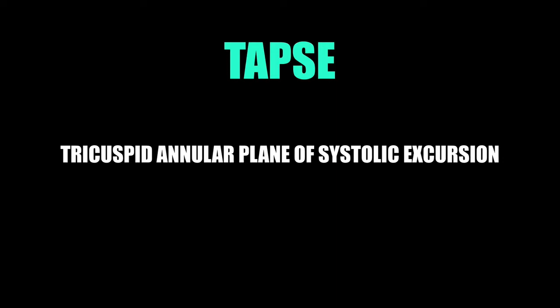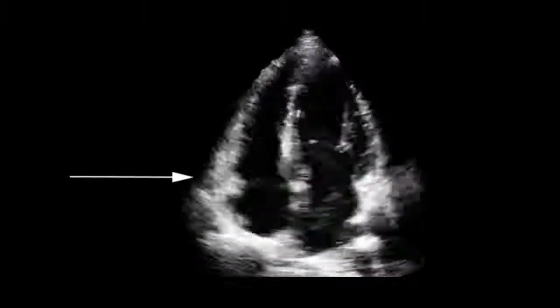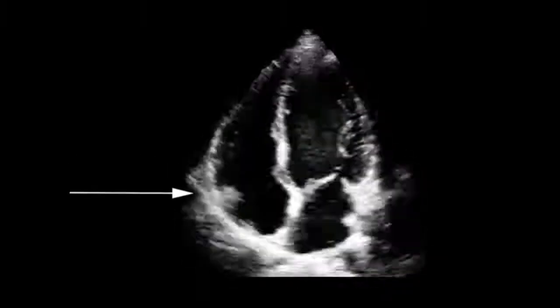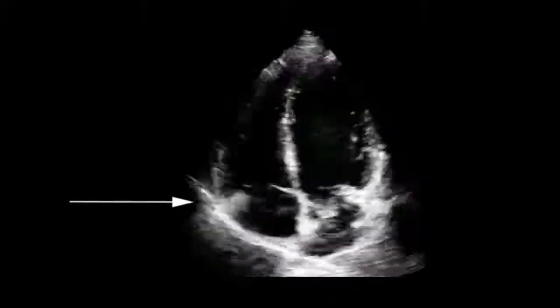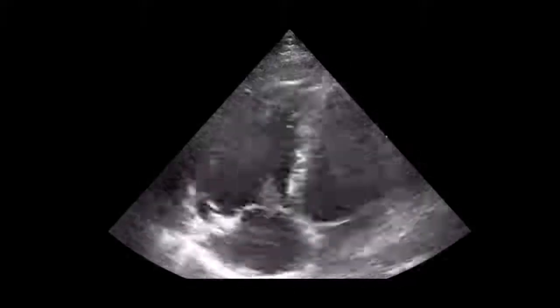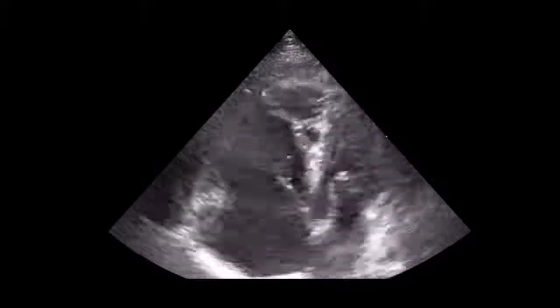TAPSE is basically how well that tricuspid annulus is moving during systole. You've got your apical four-chamber view — that's where you want to do this — and you're focusing in on what that annulus is doing. Is it moving well or is it not? You can eyeball this, but it's better to just measure it out. There's a binary thing: is it doing well or is it not?